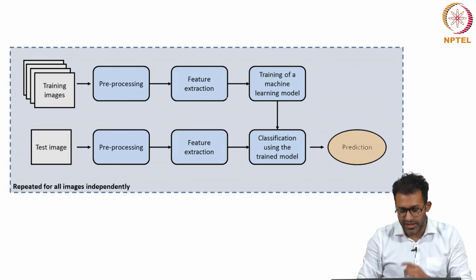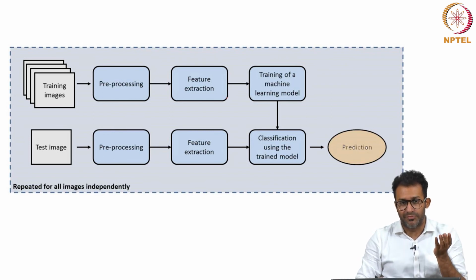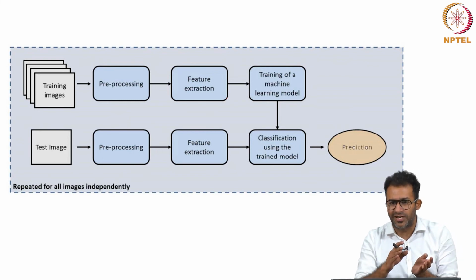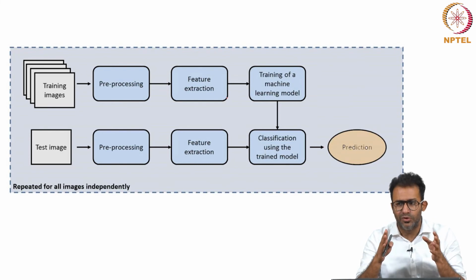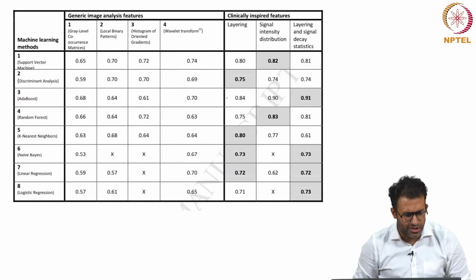There was classification again, using all these models they were able to predict the presence of cancers, and that accuracy is compared to the gold standard, which is a surgeon measuring the images or extracting those features, as well as the actual gold standard, the biopsy specimens, where you are able to confirm whether there is actual cancer or not. So, these were the machine learning models used.